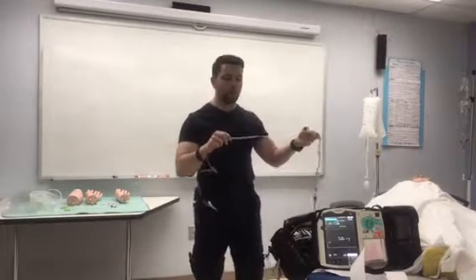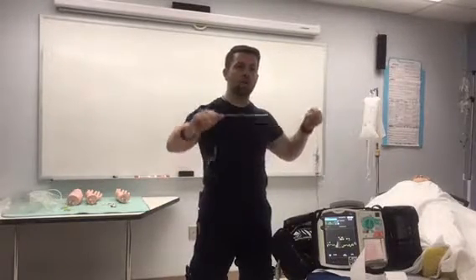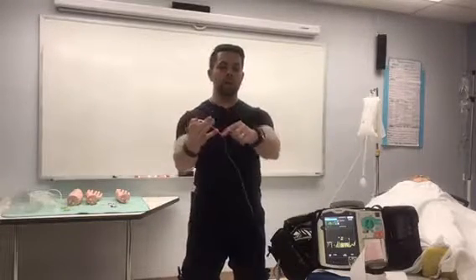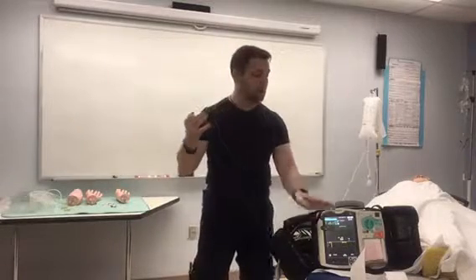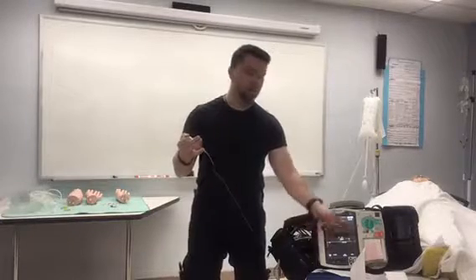The main culprit of too much dampening are all these little air bubbles that could be in there, because instead of having a nice continuous extension of your own pulse wave, every time it hits a big cushion of air, it's cushioning it, cushioning it, and the end result is you have an over-dampened system that's not portraying the pulse wave correctly.